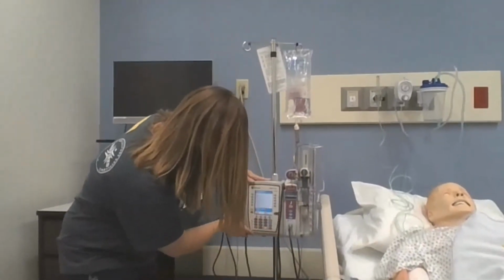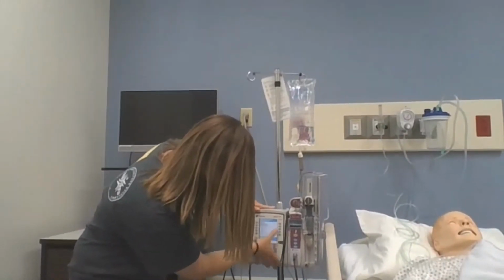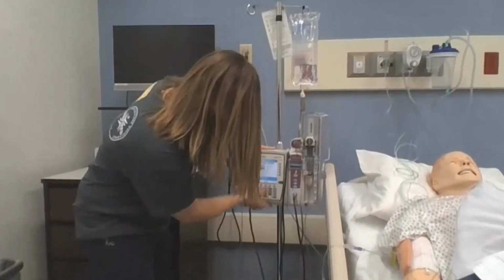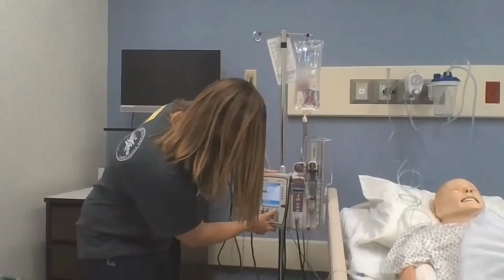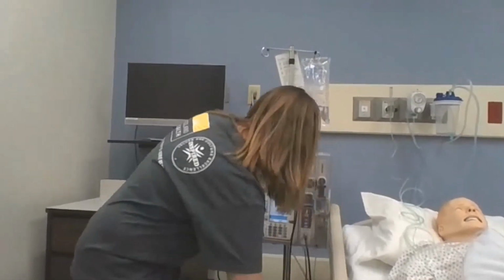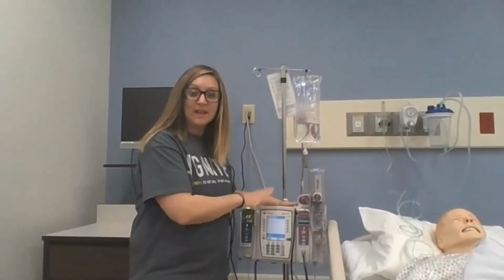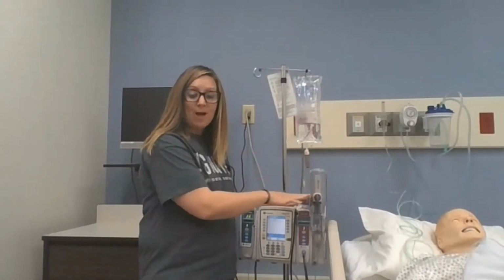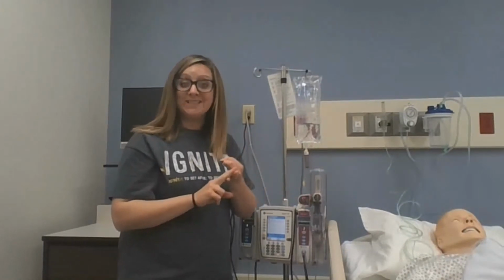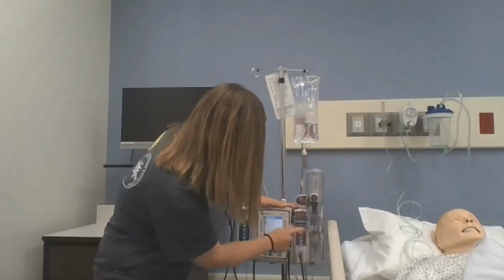I'm going to just program my primary fluids first, just to make sure that we've got those going in. Now, so I've got primary fluids infusing, and I'm getting ready to program my pump. This is where two nurses come in handy because you need to make sure that you have two nurse verification when you're programming your Alaris pump.